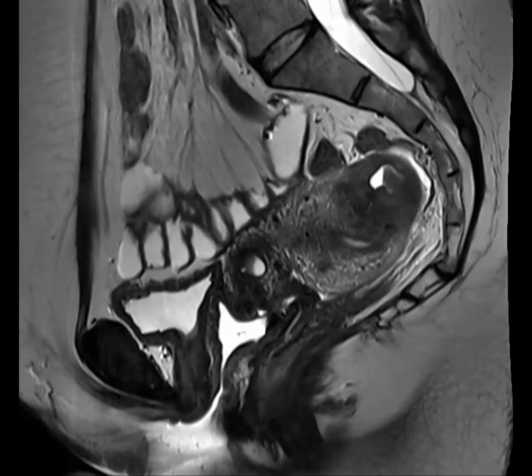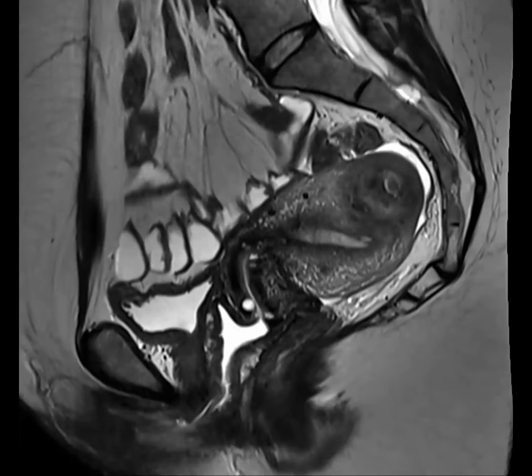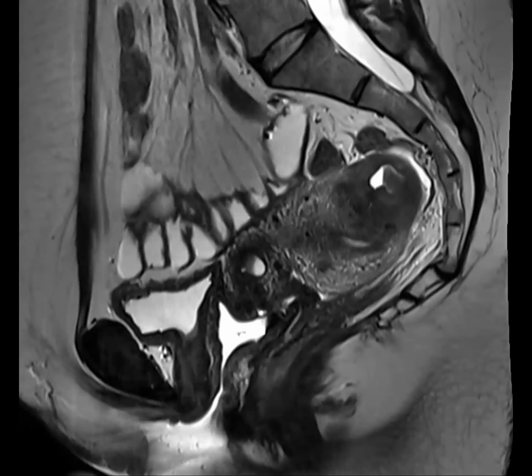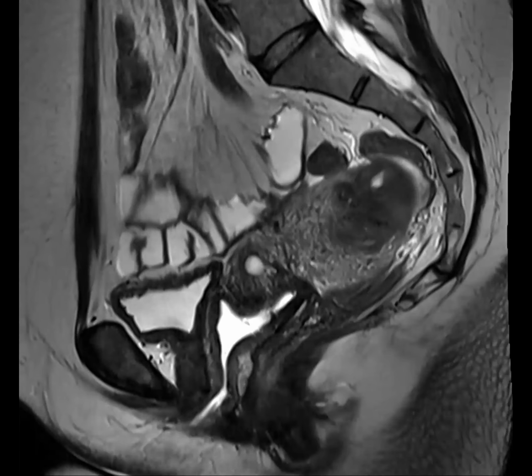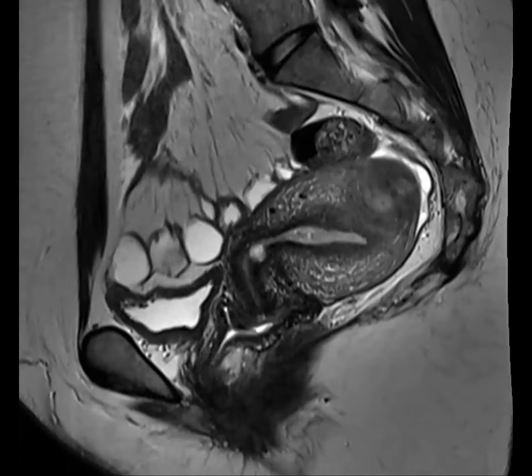It's on the spectrum of Müllerian anomalies, kind of a newly described variant. Histologically, you have endometrium centrally, which is why it's bright. This is blood, different age blood clots, and that's why you see differences in signal. And then you have a myometrial outer layer. It's round, and histologically this represents myometrium and endometrium, but it doesn't communicate with the endometrium of the normal uterus. So patients often have cyclic pain. These are often treated surgically with resection. So this is accessory cavitated uterine mass, ACUM.